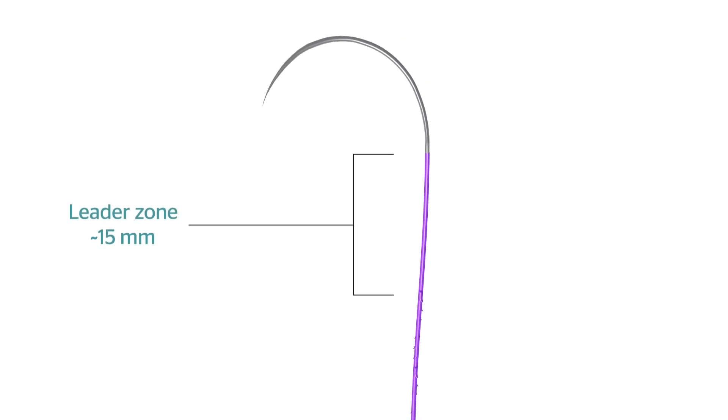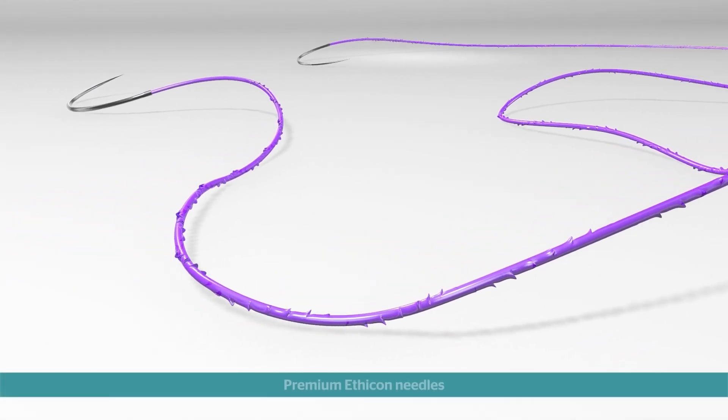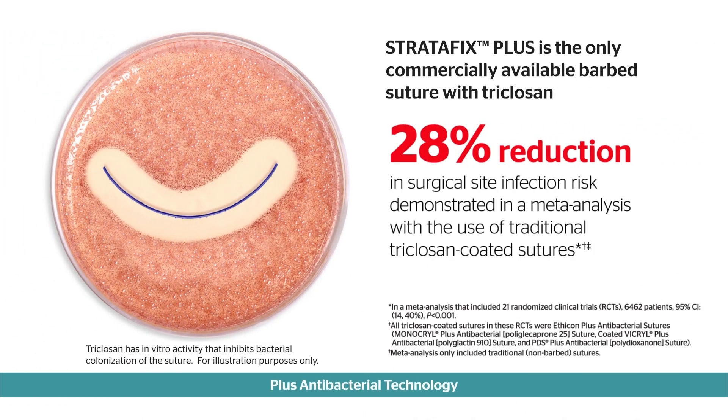The barbs change direction at the suture midpoint and run the length of the suture to the leader zone, which is the area between the barbs and the needle. Bidirectional Stratafix is double-armed with premium Ethicon needles and is now available with PLUS antibacterial technology to address a known risk factor for surgical site infection.